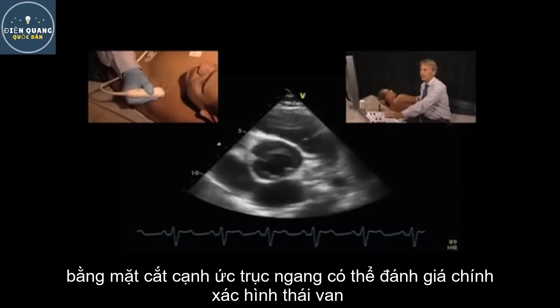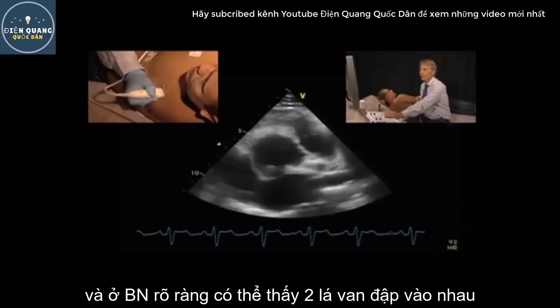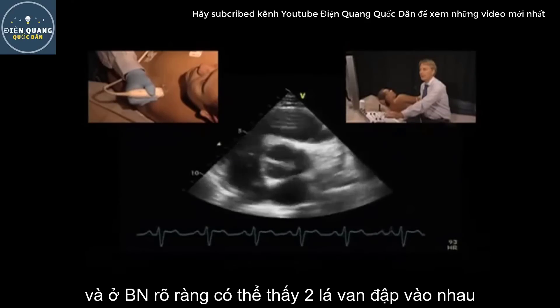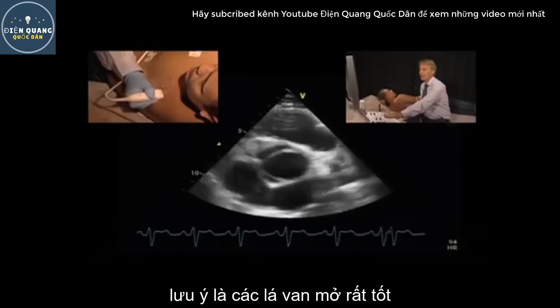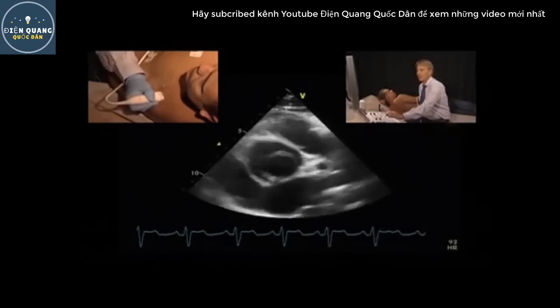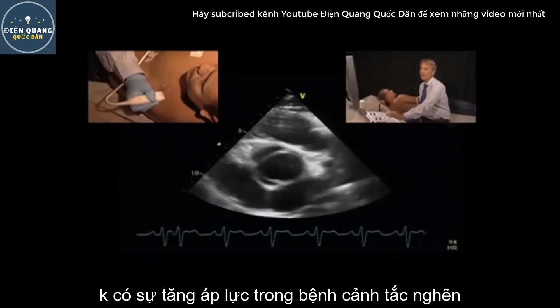We can exactly see the morphology of the valve here in the short axis view, and it's clear that the patient only has two cusps opposed to three. We also note that the valve opens quite nicely, and we do not have the impression that the valve is stenotic.